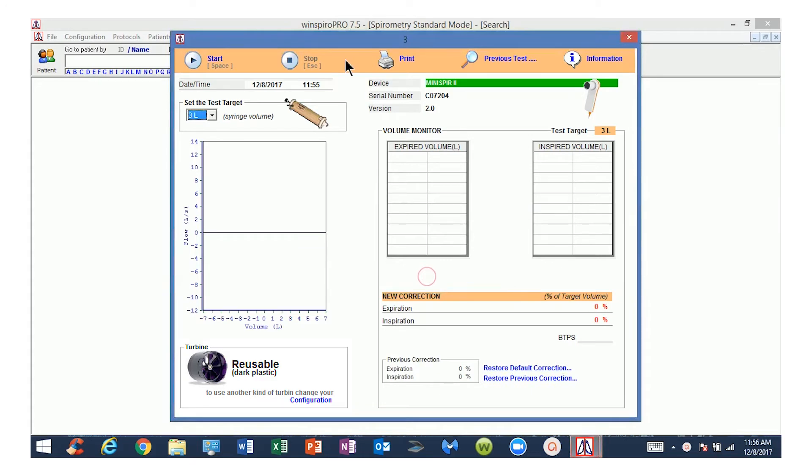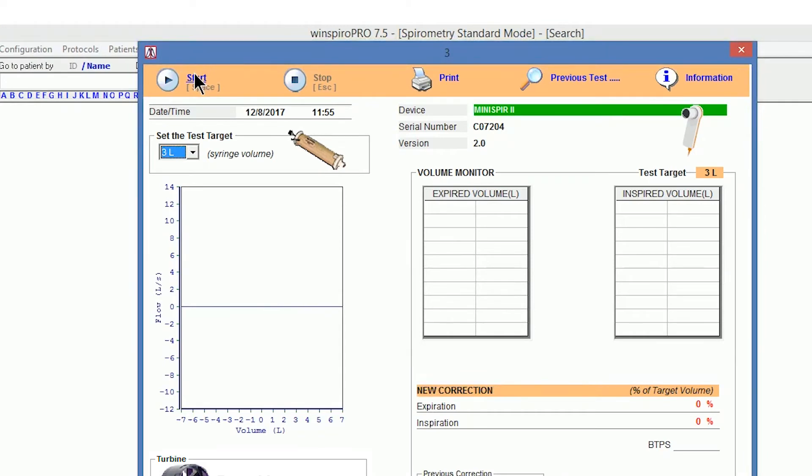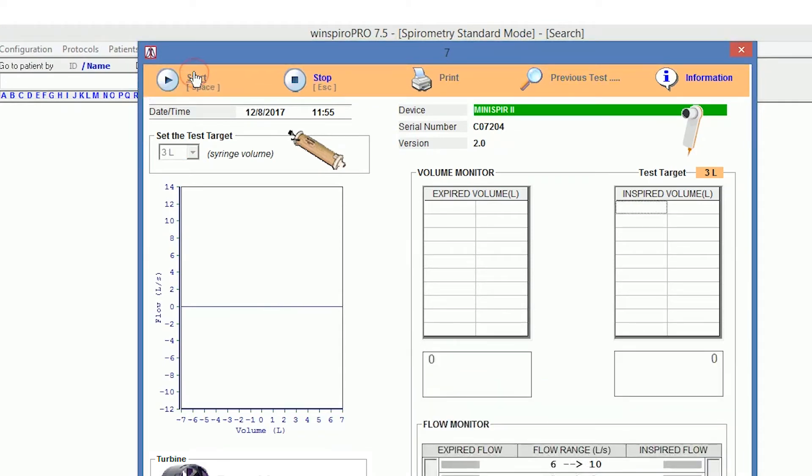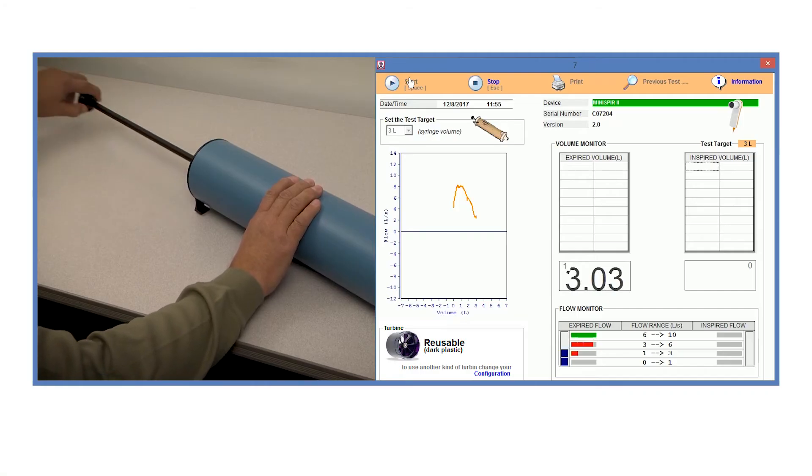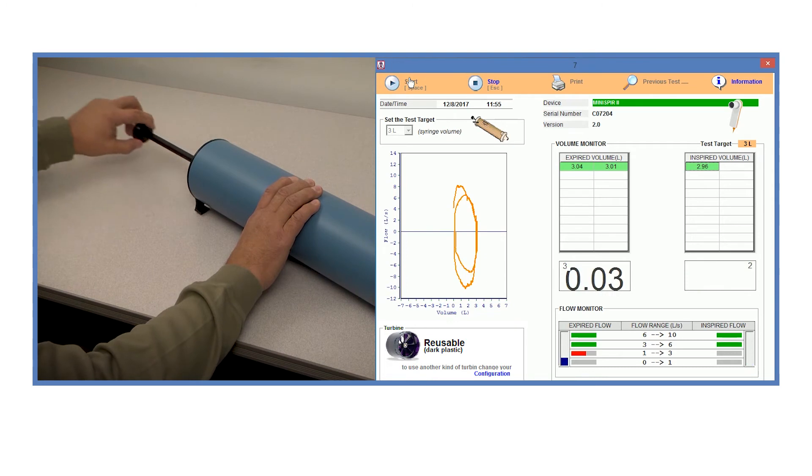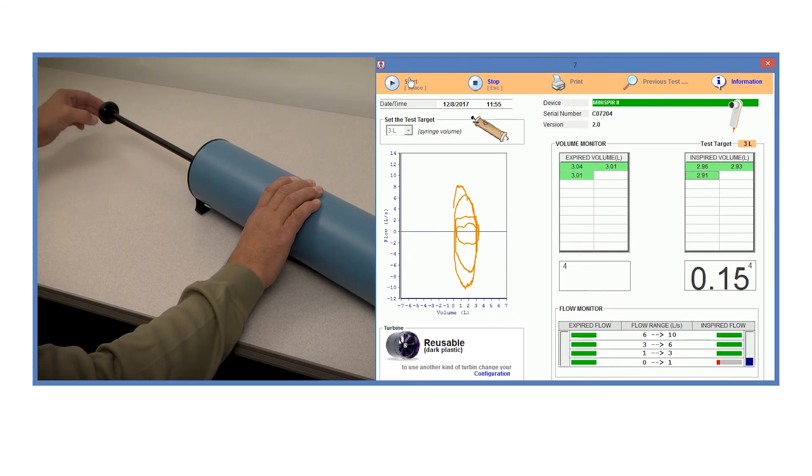You may begin the test by pressing the space bar on the computer or clicking the Start icon at the top of the screen. Begin to push the syringe piston in and out smoothly at three different speeds: fast, medium, and slow, until all the bars under the Expired Flow and Inspired Flow are green. Be sure to pull and push the syringe piston all the way to the built-in stops in each direction.